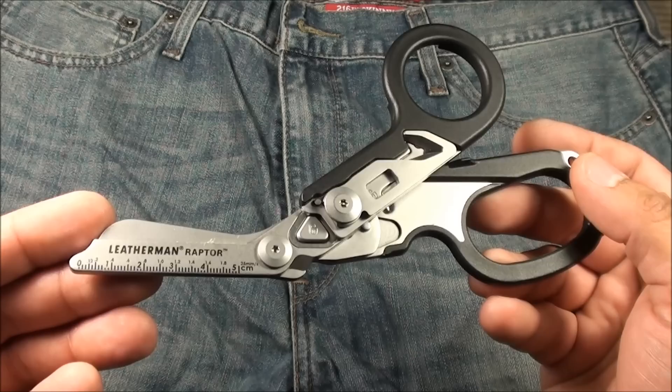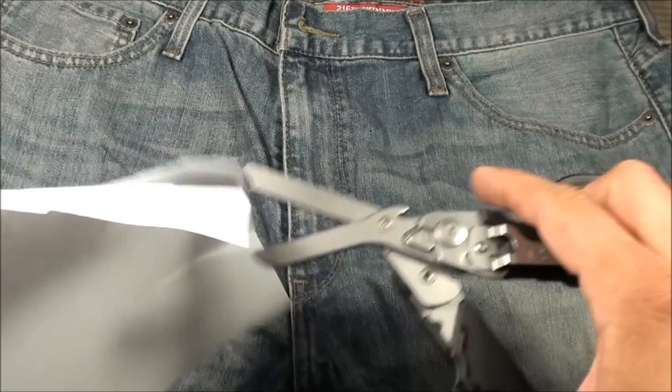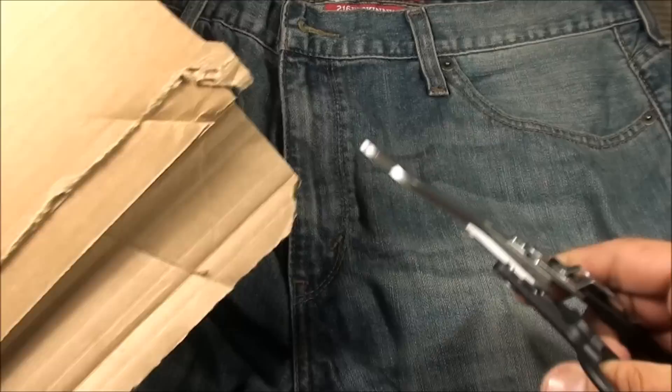The cutting power of the Leatherman Raptor medical shears is really, really impressive. By the way, it comes with a nice little five-centimeter ruler. I probably shouldn't say it can cut through anything, but sometimes it really feels like that. Cutting through paper is nothing for this thing — it goes through any kind of paper product like butter, and cardboard too. No problem.